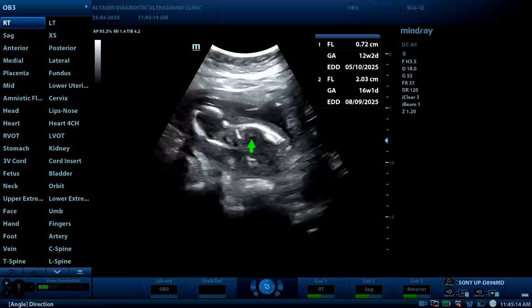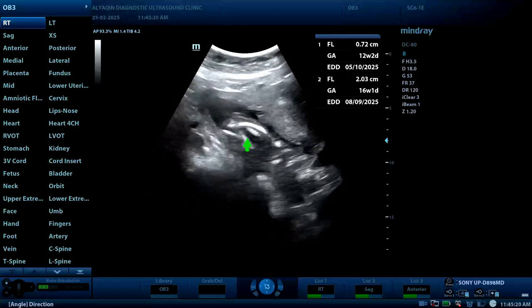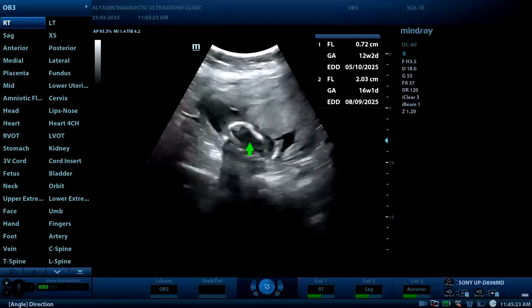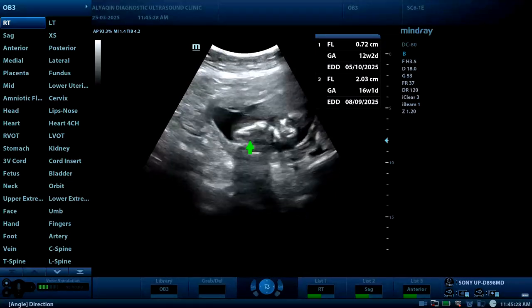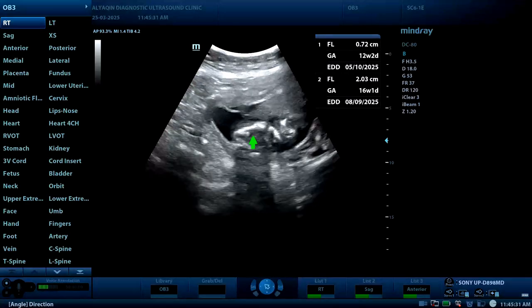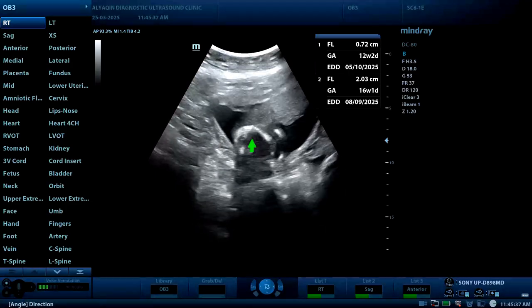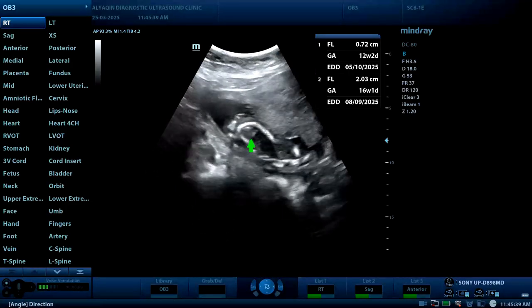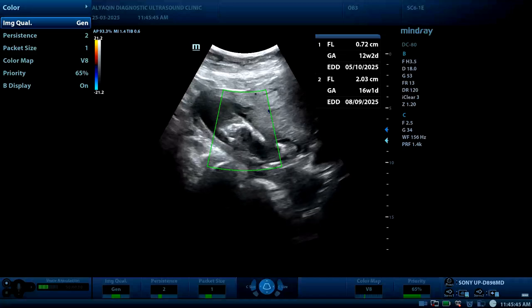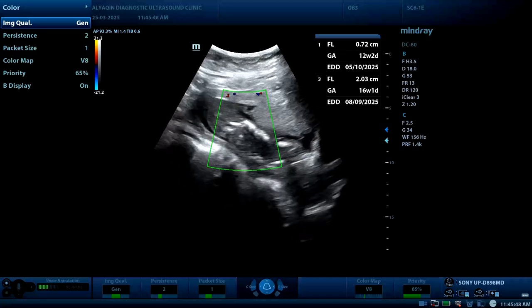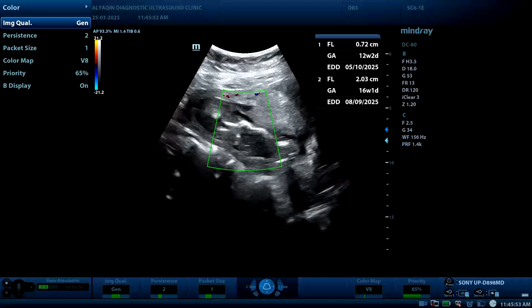The first finding is there is no cardiac activity — negative cardiac activity. The probe is now tilting perpendicularly to the heart. Again, this is the heart, and it is not active. The color box also shows no cardiac motion, so the fetal heart is non-active.